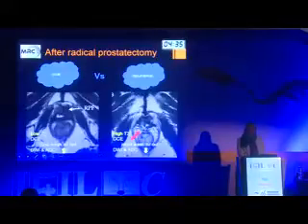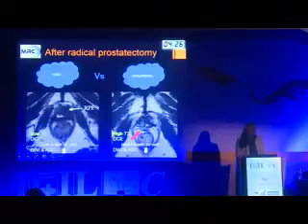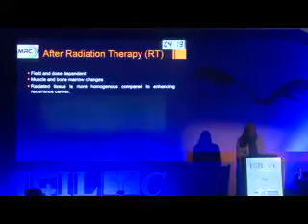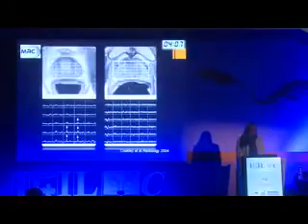But here there is an intermediate signal lesion, and notice the difference in signal between these two lesions. This is actually recurrent tumor at the operative bed. After radiation therapy, it is very crucial to assess if the patient is a responder or a non-responder. But the timing is very crucial to assess this entity, and it should be postponed at least 3 months after stoppage of radiation to allow the inflammatory process to subside.